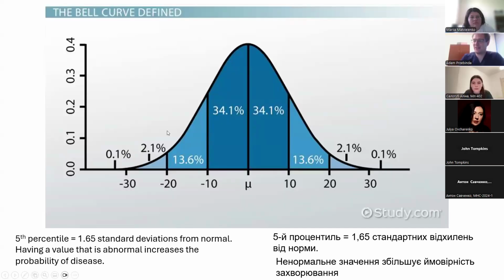So you see here, each of these graphs has to be generated for patients that are 65-year-old women with a height of 5'3", or 160 centimeters. If you find 1,000 people like that to do lung function tests, you can generate this. If you have an 85-year-old, it's harder to find 1,000 85-year-olds. And it's almost impossible to find 1,000 95-year-olds.